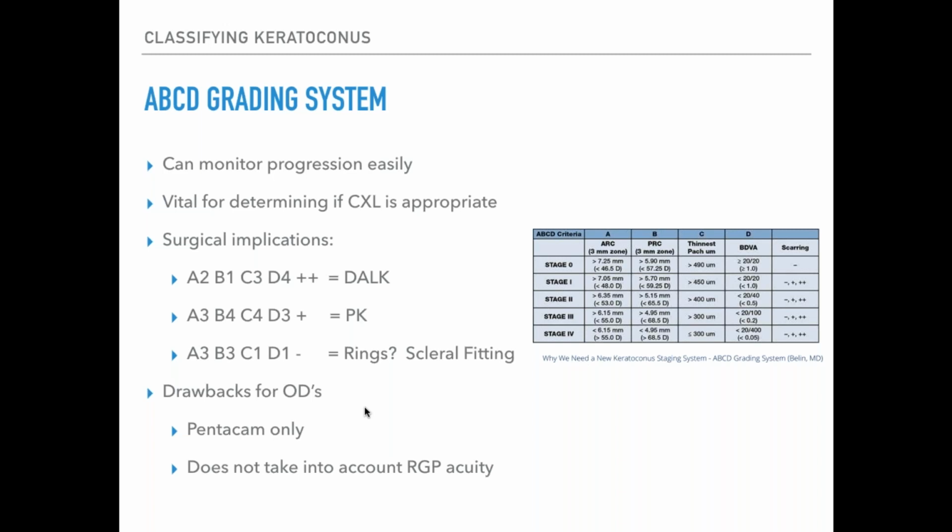If I catch an early patient, I suspect keratoconus in their teens, I'll send them off just for a Pentacam. I'll have these readings done, I'll have it come back to me, and I get a few bucks in reimbursement, but really I'm able to better monitor their condition, and it makes the system more viable to me in those patients where I have access to that information.